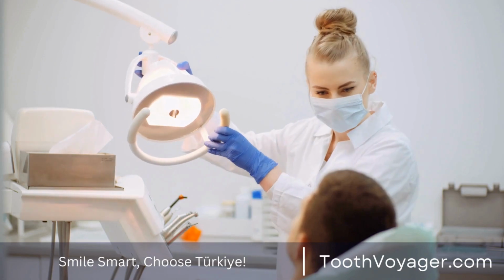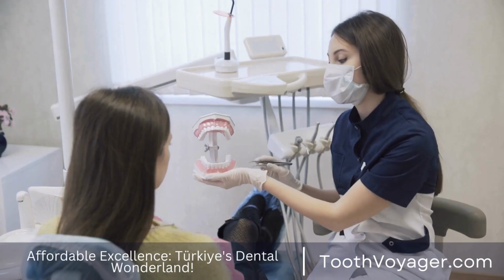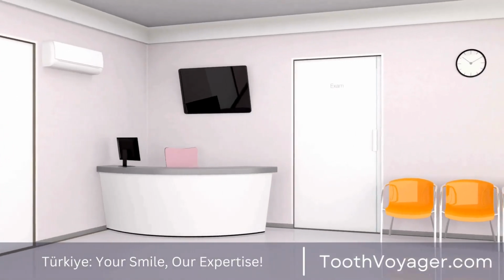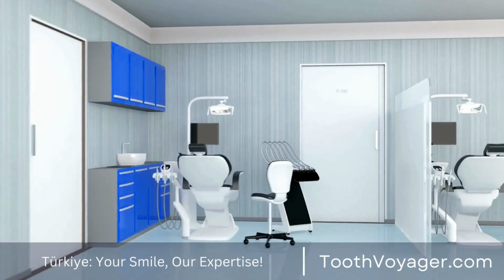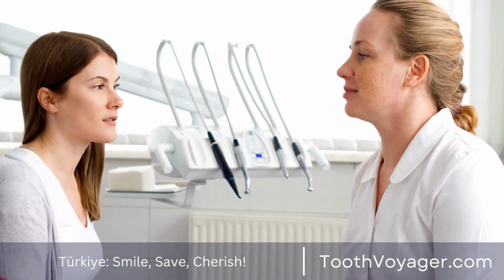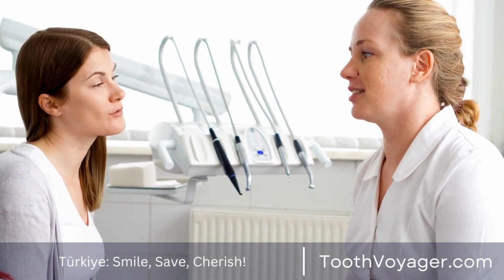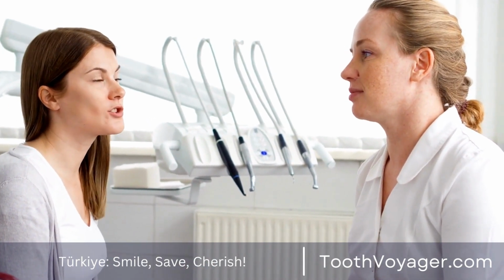The use of dental crowns is to fulfill a myriad of needs such as: 1. A tooth with a weak structure. The use of dental crowns is to safeguard a weak tooth from decay and further harm. When a tooth is damaged by decay, an extensive filling, or even a root canal, a dental crown could help to make the tooth stronger and guard it against further harm.